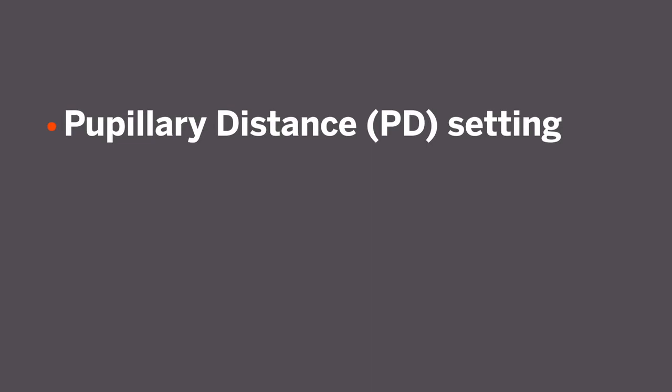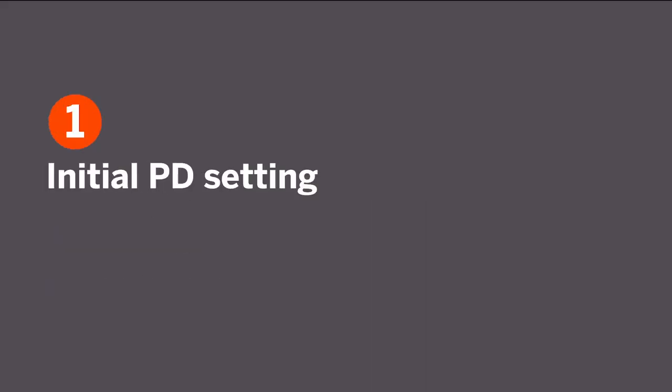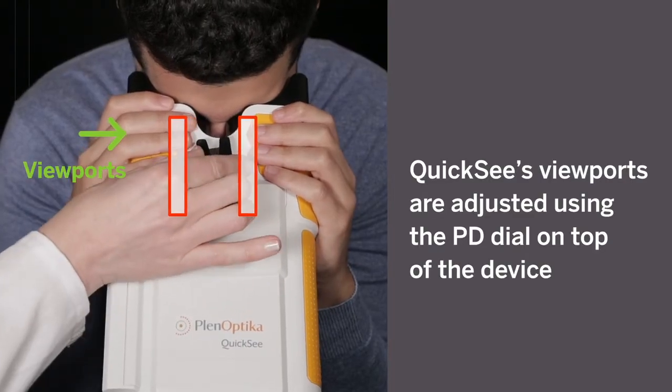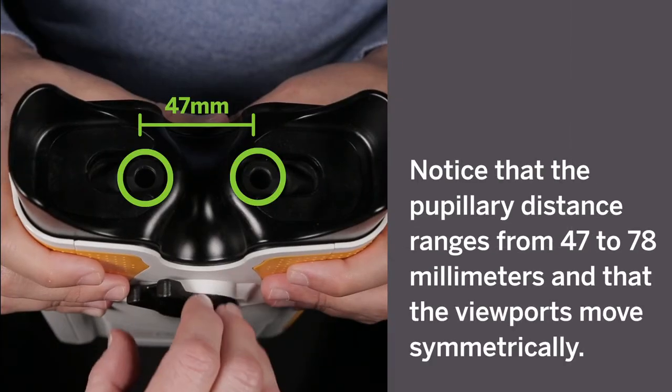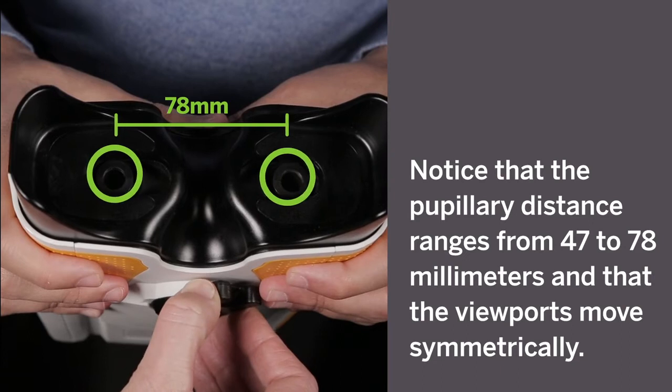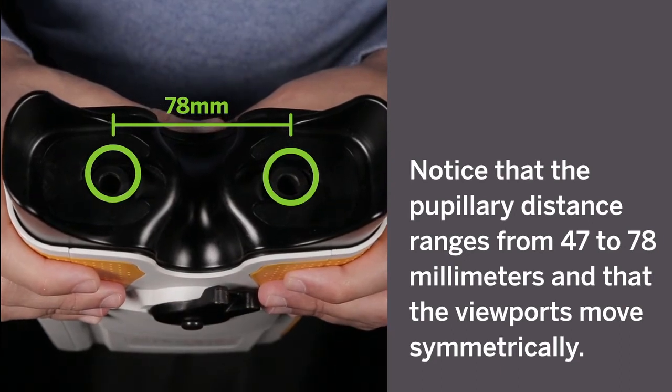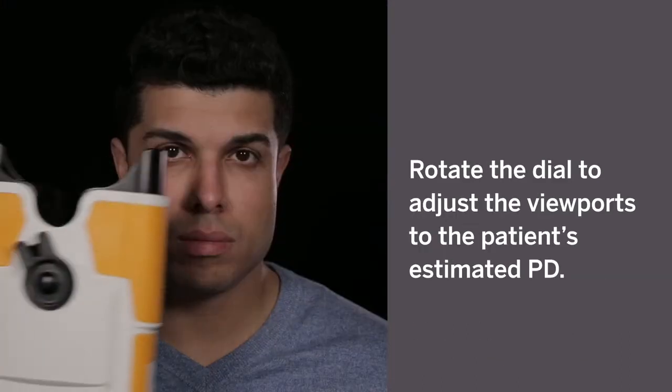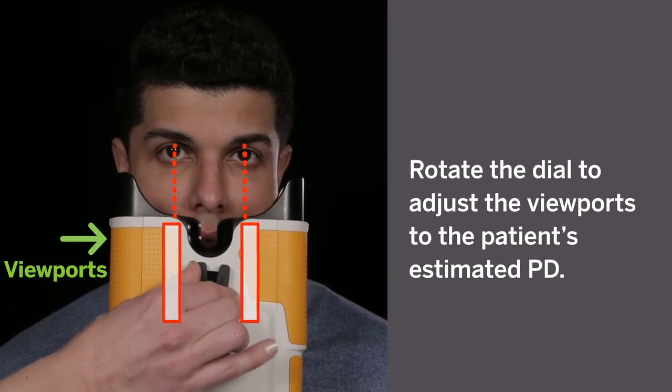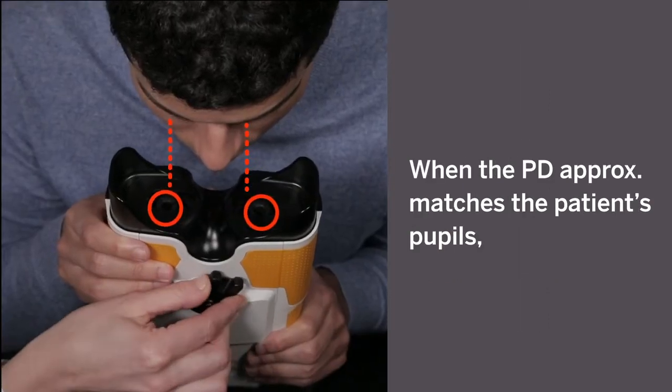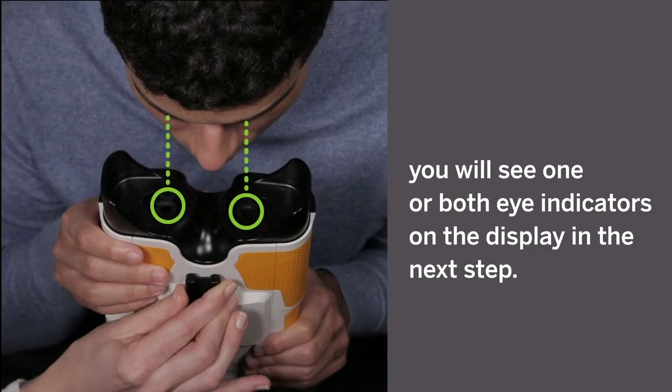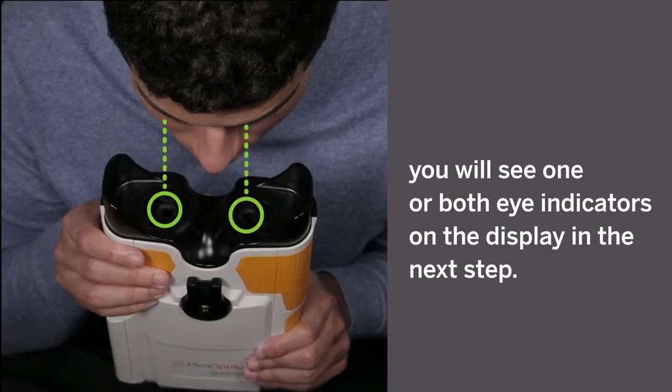Solutions include pupillary distance setting, seating, leveling, and fine-tuning. First, initial PD setting. QuickSee's viewports are adjusted using the PD dial on top of the device. Notice that the pupillary distance ranges from 47 to 78 millimeters and that viewports move symmetrically. Rotate the dial to adjust the viewports to the patient's estimated PD. When the PD approximately matches the patient's pupils, you will see one or both eye indicators on the display in the next step.